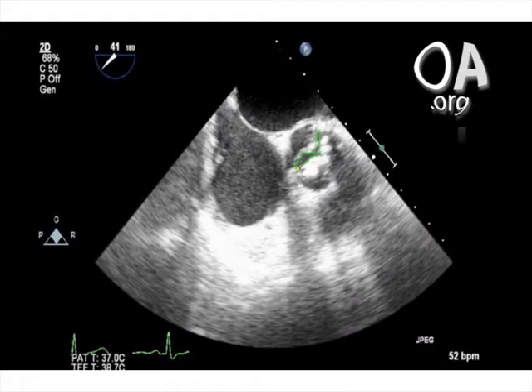This is the planimetry of our patient's aortic valve in short axis as described above. The image is frozen in systole, when the aortic valve should be open to its maximal orifice to allow the ejection of blood flow. Appreciate the very small, irregular stenotic orifice. This planimetry method is difficult to perform accurately, as the bright white calcium artifact can cause underestimation of the true orifice of the valve. Planimetry in this patient measured an aortic valve area of 0.6 centimeters squared.